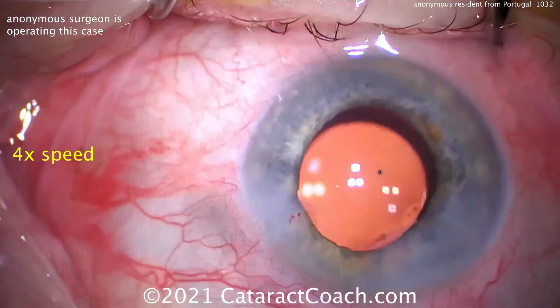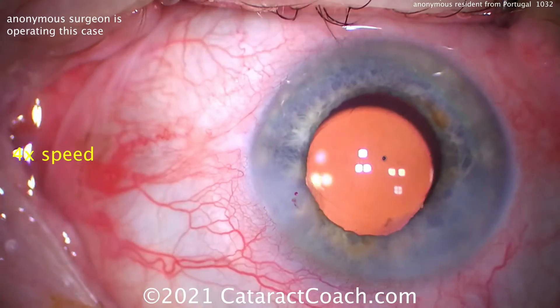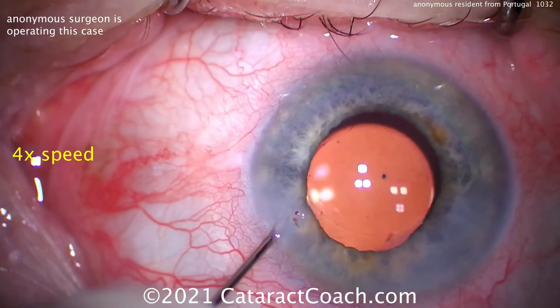That rhexis too — needs work. But the chop was beautiful, and we'll give you an A for the chop. Just fix that incision. Thank you.